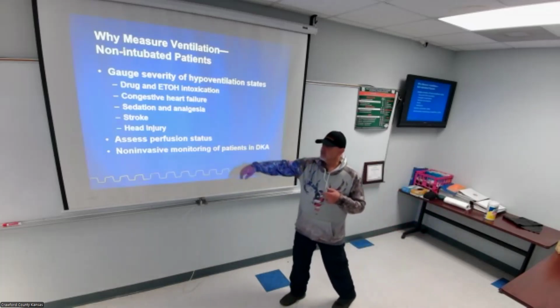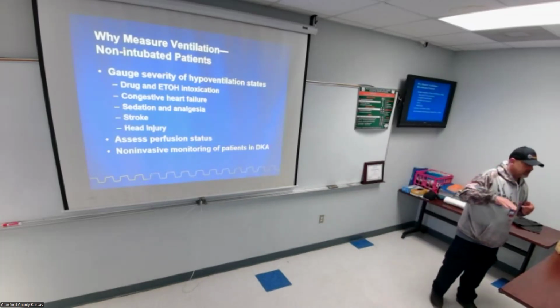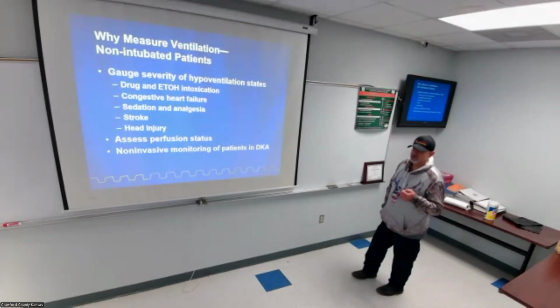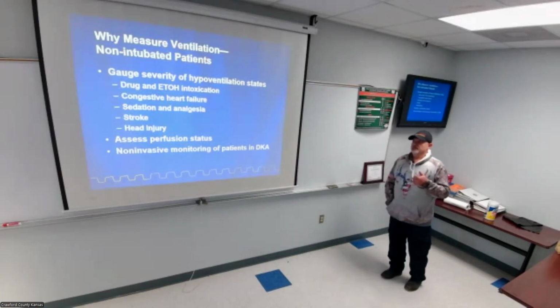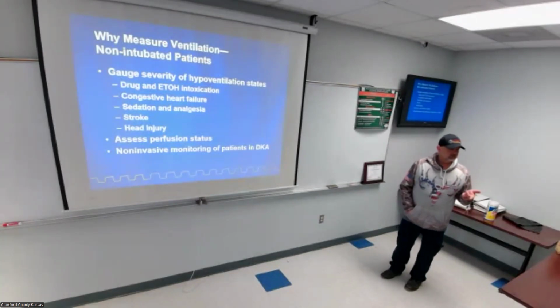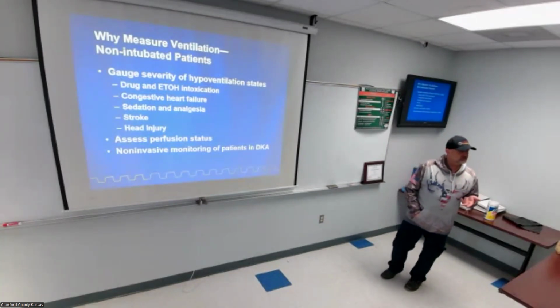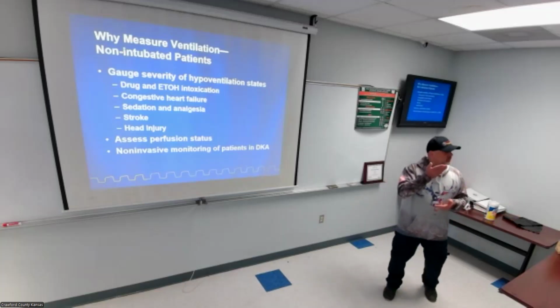Head injury, we're looking at Cheyne-Stokes. It's kind of a little different. It can go fast, and you're going to have your slow processes. Drug and alcohol intoxication, usually going to be slow respiratory drives. Congestive heart failure, once they get to the point that they are in full failure, like we were saying a while ago, what happens? Pulmonary edema, respiratory drive starts slowing down. In that case, that's where we have that flip that you were talking about, where the end-tidal will go up instead of down.